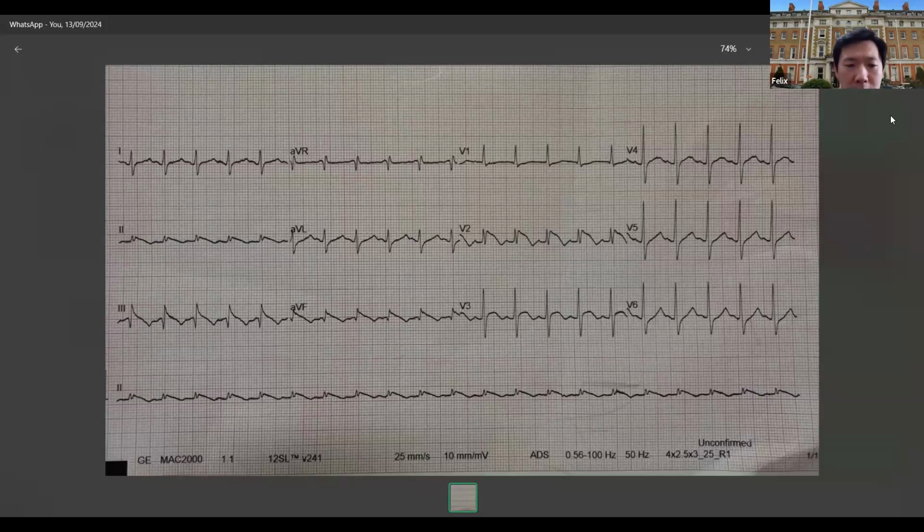So actually, this is a teenage patient. She had aplastic anemia, and she came to the hospital with a little bit of shortness of breath, but not ventilated. But she also had anemia. At that time, I just wanted to check the ECG rhythm, and it showed like this. I had no clue at that time, and then, less than 24 hours later, she had a sudden death.